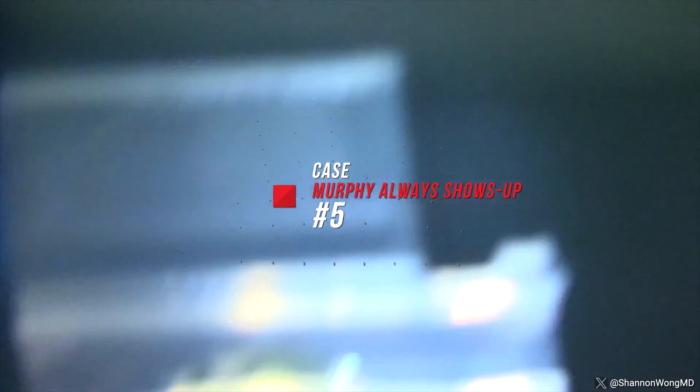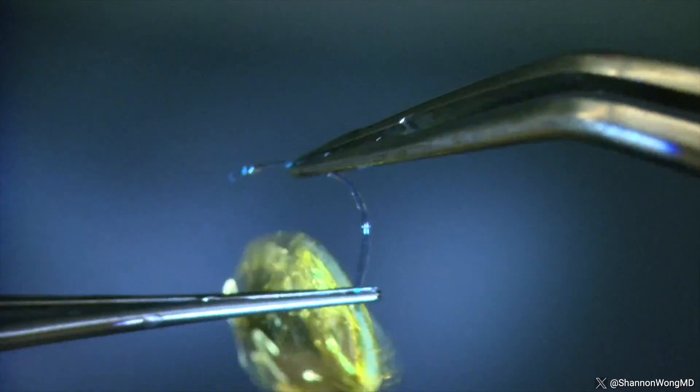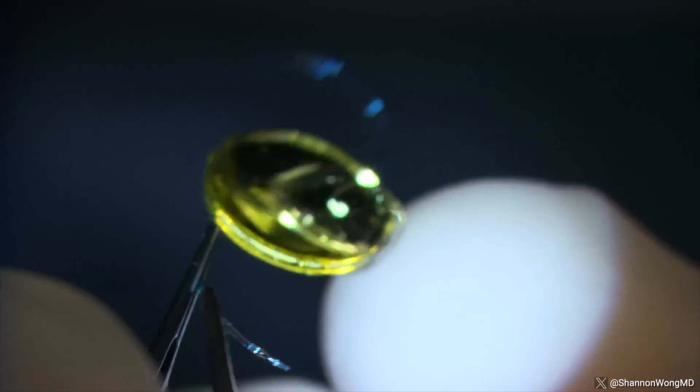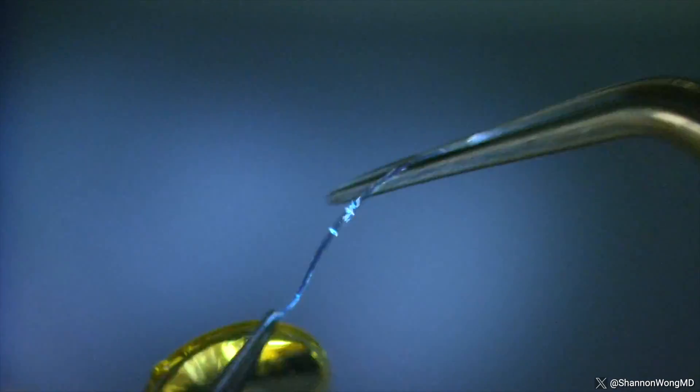Case number five: Murphy always shows up. Just when we think we have all the bugs eliminated from our LAL insertion process, let me share one final case. We load the lens in the usual manner, then begin to push the LAL through the insertion cartridge when we notice that the leading haptic is kinked or folded backwards toward the LAL optic. If we insert the lens into the eye the haptic will be bent and the LAL will not center normally. So we reopen the insertion cartridge, remove the LAL, and inspect the bent leading haptic. Then using two forceps, we methodically reshape and reconfigure the leading haptic into a normal conformation, carefully ensuring the haptic is in the correct shape and angulation. We then reload the same lens into the injection cartridge and deliver the LAL successfully into the eye.